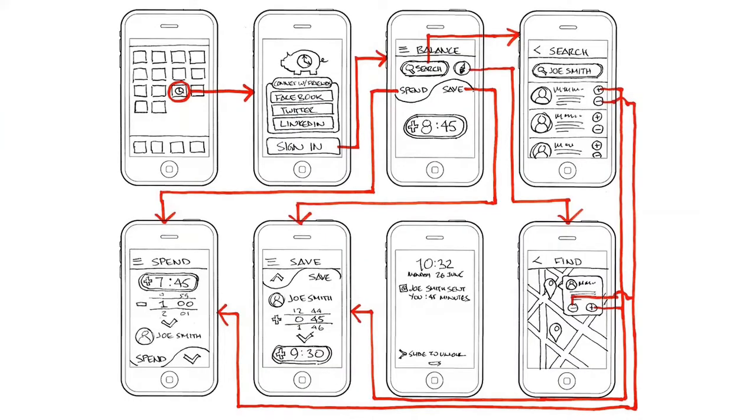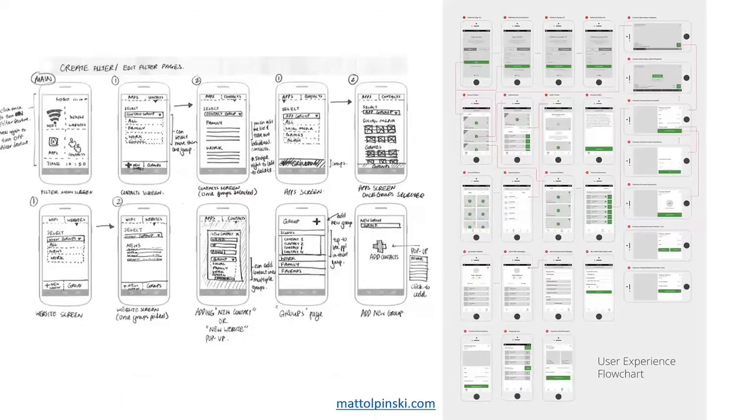These are some of the ways that we work through it. So these are rough prototypes and sketches trying to work out the hierarchy and interaction of all the various elements and buttons. In the old days, we used to do this literally with what was called paper prototyping, and you'd have rolls of paper and post-it notes which you'd try and map all of this out. These days it's more sophisticated, so there can be more sophisticated hand sketching. There's a lot of software that allows you to map all of these interactions. And it's always the user experience flowchart.